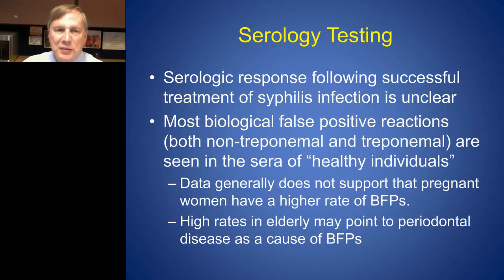Okay, some of the questions that came up: the serological response following successful treatment of syphilis infection was really unclear based on treatment and stage. If somebody's treated very early, what happens serologically? We do know that with successful treatment the RPR generally goes away, but what happens to the long-term effect on the treponemal test if they're treated very early? Does it disappear? If they're treated later, in secondary syphilis, it appears that it doesn't.